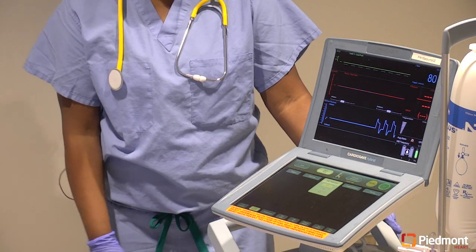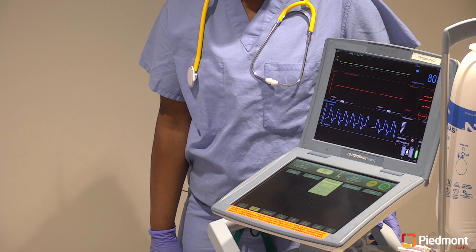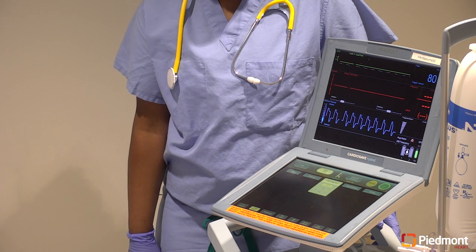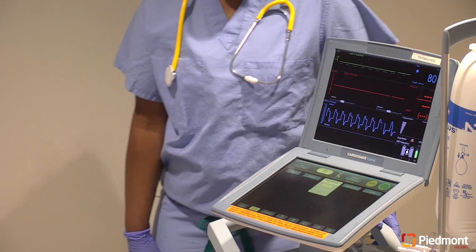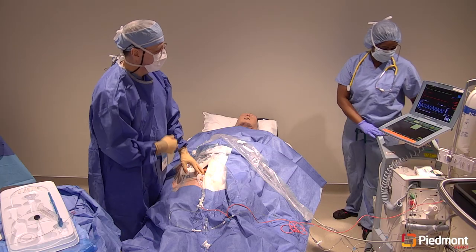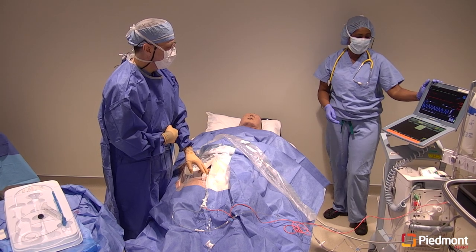Once the order has been given from the provider to start, press the start button. Ensure the screen is viewable to the provider as you both take a moment to analyze. Okay. All right. Thank you, Nancy. All right, Dr. Barrett, I think we're done.